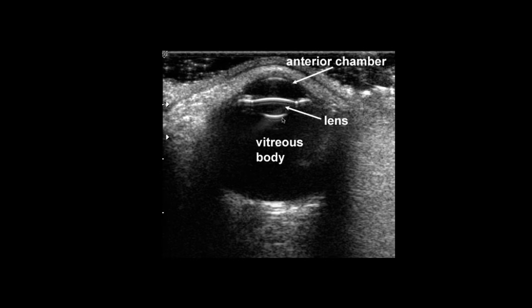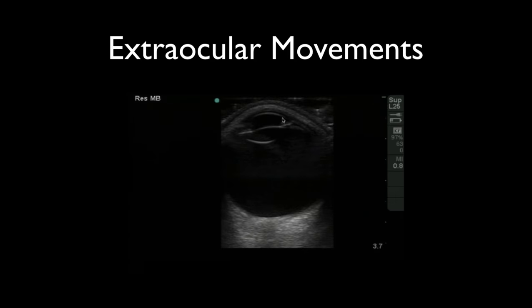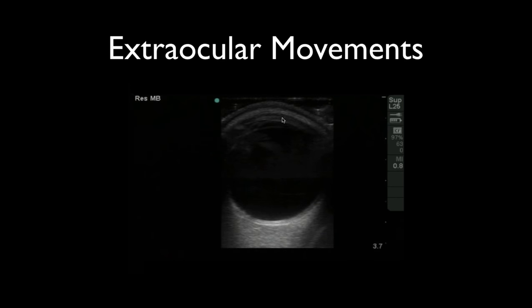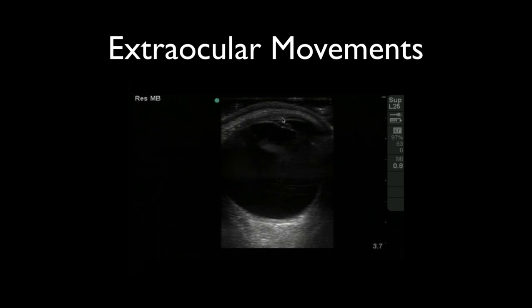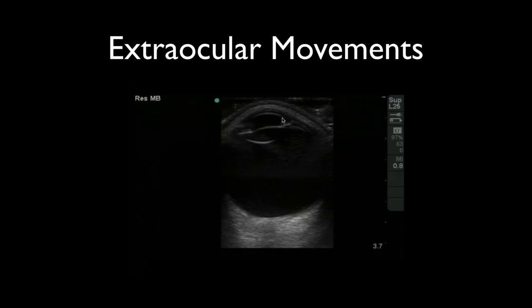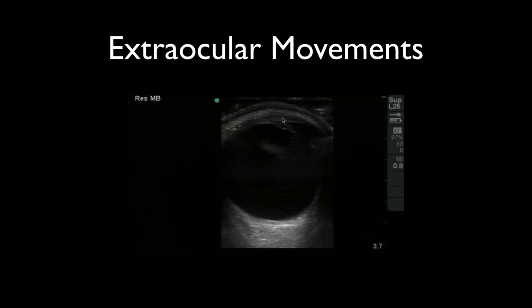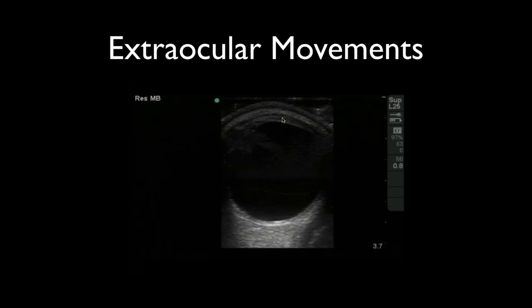A nice thing you can do with ultrasound is evaluate extraocular movements. With the patient's eye closed under the tegaderm and gel, say 'look right, look left, look up, look down' and you should see smooth movement. You're looking in the posterior chamber for any hemorrhage or detachment. These are all examples of normal eyes.